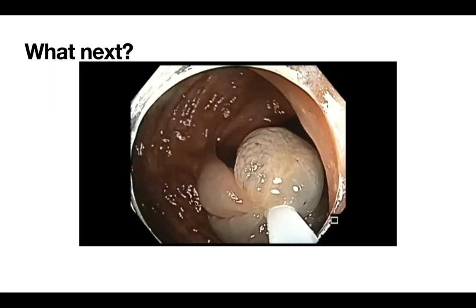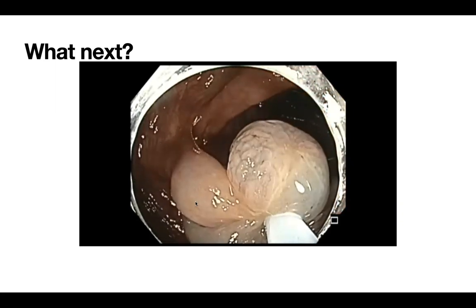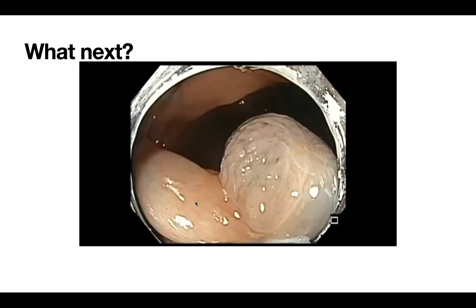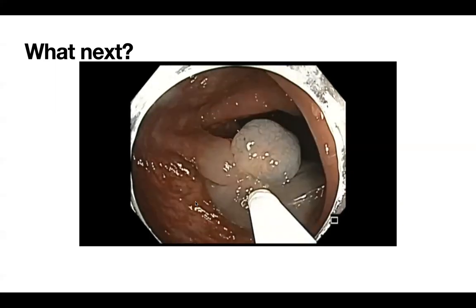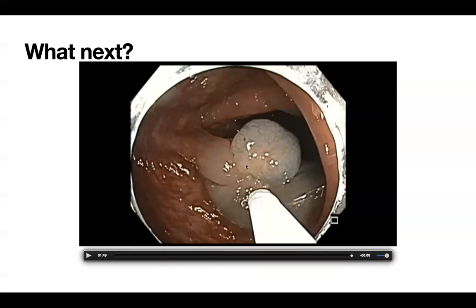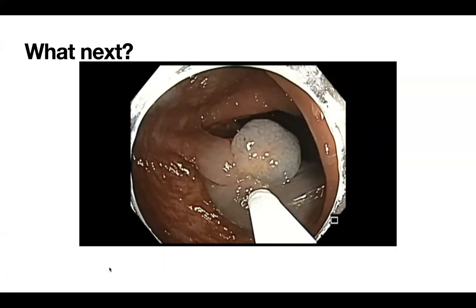As long as your resection is in the submucosa and doesn't go into the muscle or involve the muscle, you'll have fewer issues with delayed post-polypectomy syndrome or perforation. So something to just keep in mind. And I will take you to the next step.